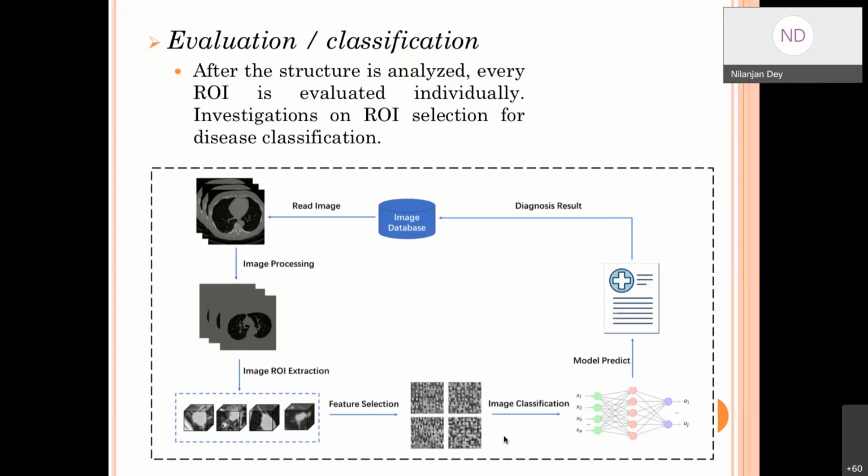Why? The storage of the image should be lesser, because if you represent the image in 2 gray shades or say 3 gray shades, then automatically the number of gray variations will be lesser and the storage space will be lesser. So in this way, you can partition the image into foreground and background, into region of interest and non-region of interest. We always try to find out that this particular location is my actual region of interest. But there are different challenges in medical image segmentation, which are not there in other kinds of segmentation. Let's suppose there is a disease called atherosclerosis. What is that disease?